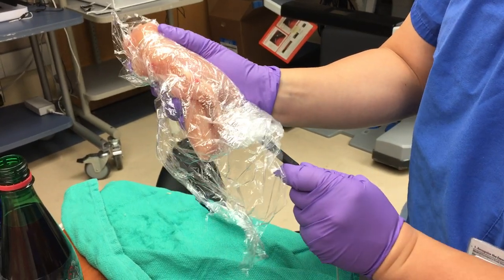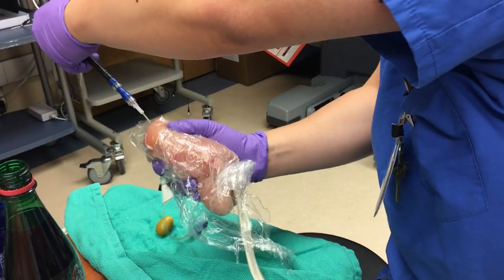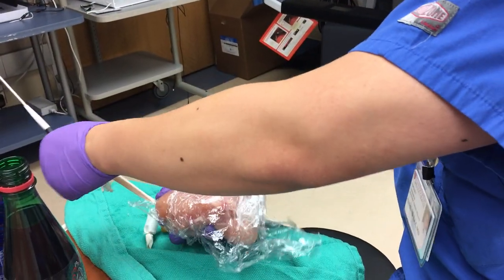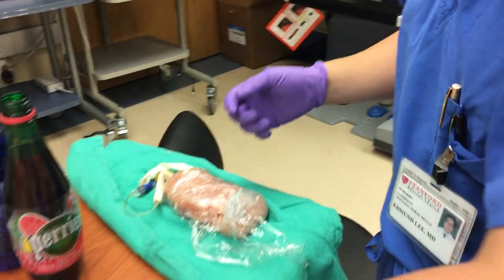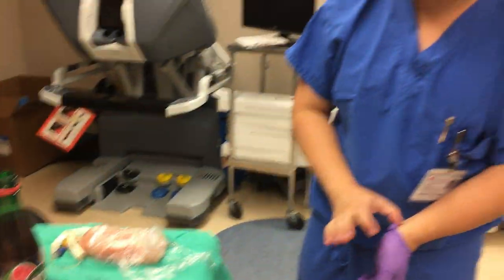There we go. Flush with the tubing. So, the next step is to add the fluid within the tubing.